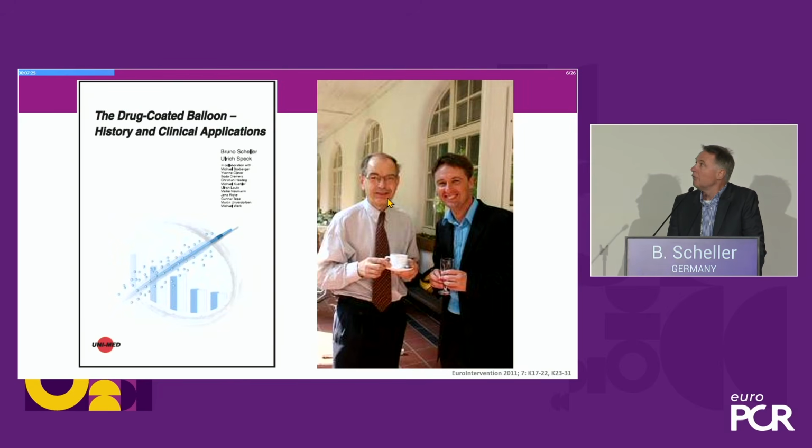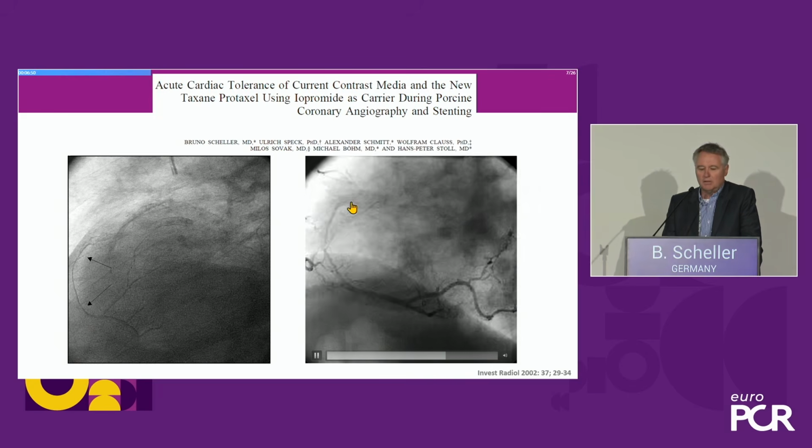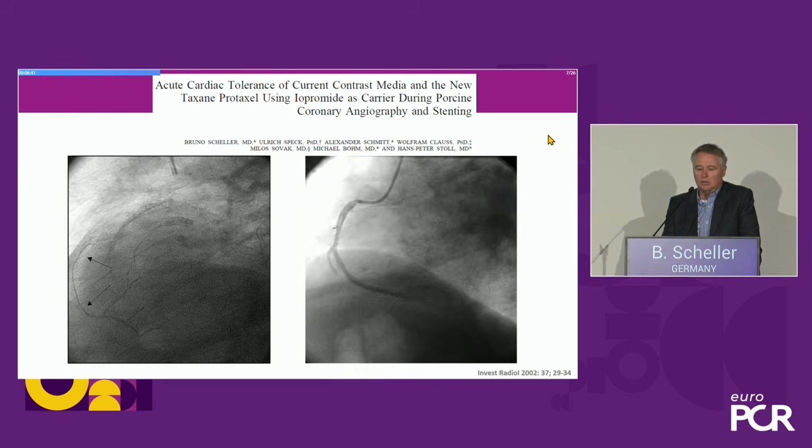And the then head of R&D for contrast media was Professor Ulrich Speck. And he was very kind to me, and the other people also. And he was interested in how we can improve contrast media, because there was nothing new anymore at this time. And I was under the impression of this paclitaxel stent presentation from the TCT, and so we said, okay, let's try to use the contrast media as a tool for intravascular local drug delivery. And if you look, for example, at this right coronary artery here, after the injection of the contrast medium, you see a thin film staying there, and that was the idea to use this effect.